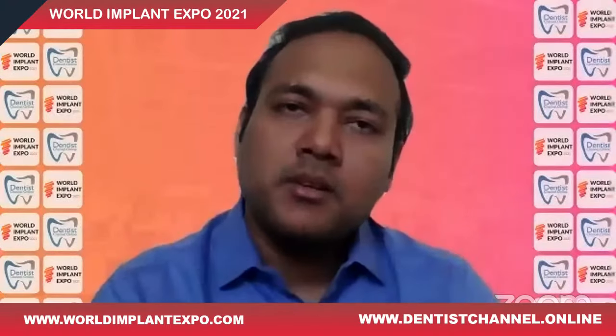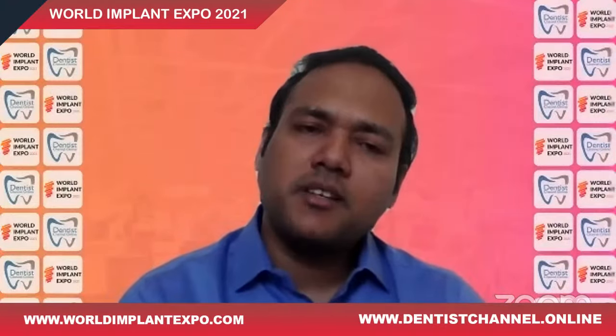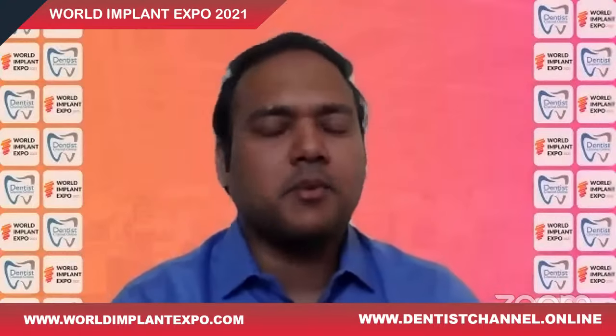Even if you check some of the CBCT reports, they used to give us D1, D2, D3, D4 values, but they may not be accurate.